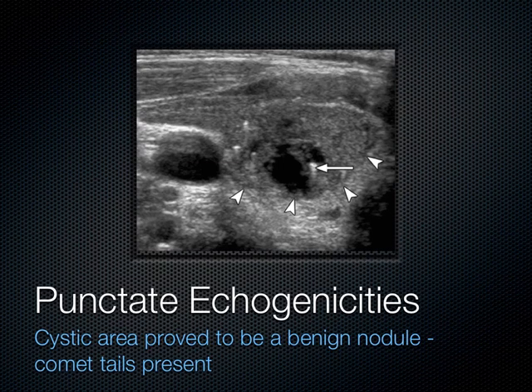And this is what that reverberation artifact, that comet tail, looks like. Colloid crystals will cause these comet tails. With benign nodules, there's a lot of times colloid crystals in there that result in comet tails. So comet tails in the thyroid, good.